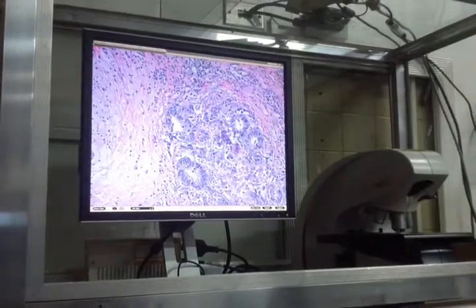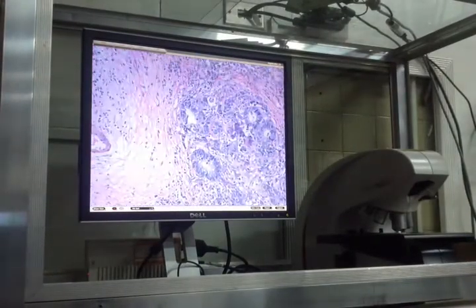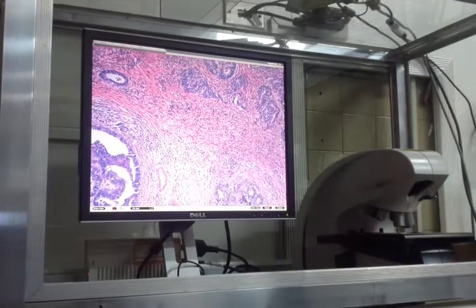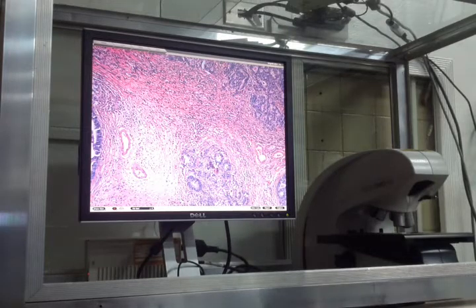it. What do you call that? Fibrosis surrounding the neoplastic cells. Kaya yung nakapaligid dun sa labas na color, matigas. Dahil doon. Ano yun? Desmoplasia. Tawag doon, ladies and gentlemen, desmoplasia.